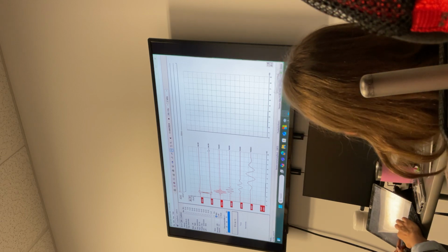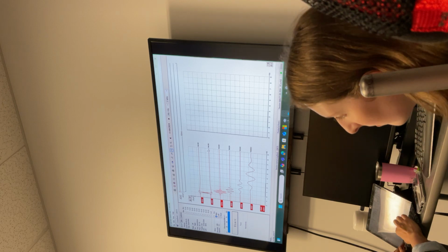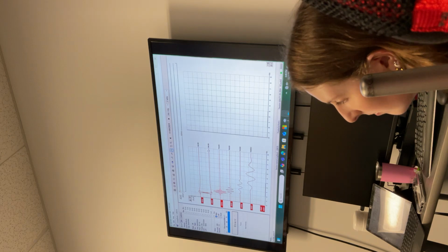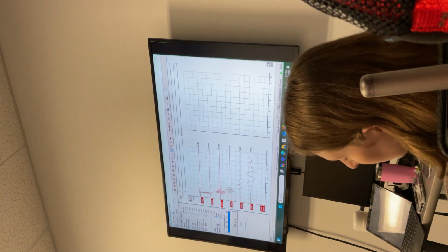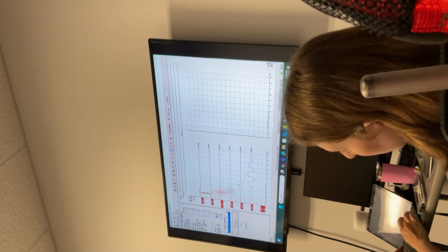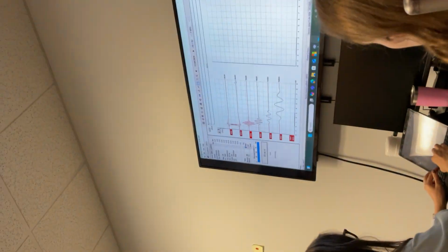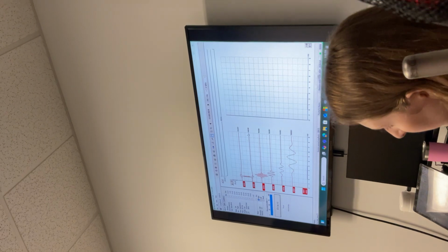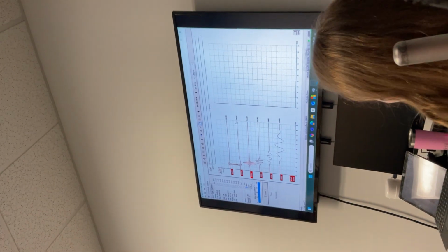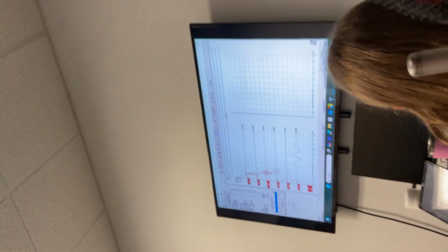Because when the sound is sent through the transducer, there's a trigger telling the software, I played the sound now. That's why it is used for averaging. That's why the averaging technique is called time-locked averaging. So 0 denotes the onset of the sound. On the x-axis on the recording waveform, 0 means that's when the sound is played.